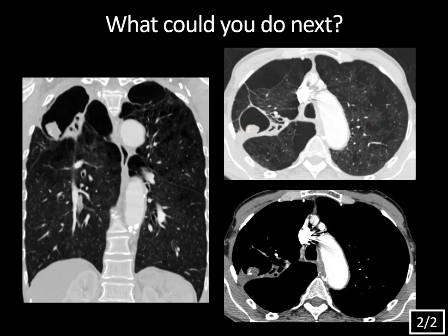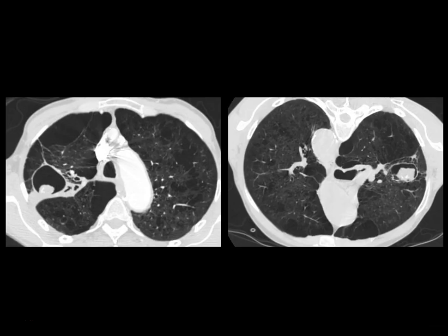On soft tissue windows, the nodule has soft tissue density and a few calcifications. Even though this is a thin-walled cavity, you want to make sure this is not a cavitating lung carcinoma with a mural nodule. You can scan the patient again in the prone position — ideally with a low-dose technique. In the supine series the nodule is dependent, and when the patient is flipped prone, the nodule remains dependent: it follows gravity and moves. If this were cancer with a mural nodule, it would remain fixed to the posterior wall. The cyst cavity also decreases in size due to physiologic compression. This is diagnostic of aspergilloma.